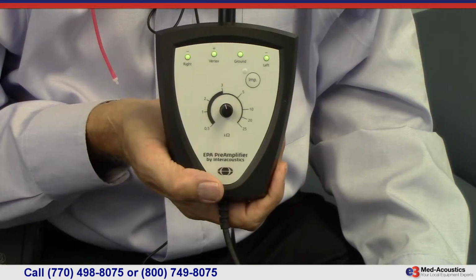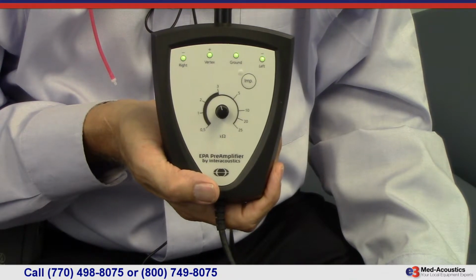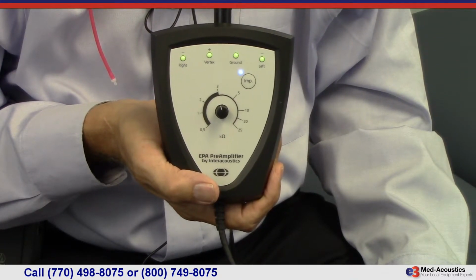And as you can see here, this is the impedance test on the Acoustics Eclipse, and there's a button right on the preamp, and you can push that, and you have an LED light for each electrode, each of the four of them. It's either red or green. Green means that it is at least as low or lower than the dial setting. So ideally, for all electrophys testing, we put the dial at 3, means 3K.